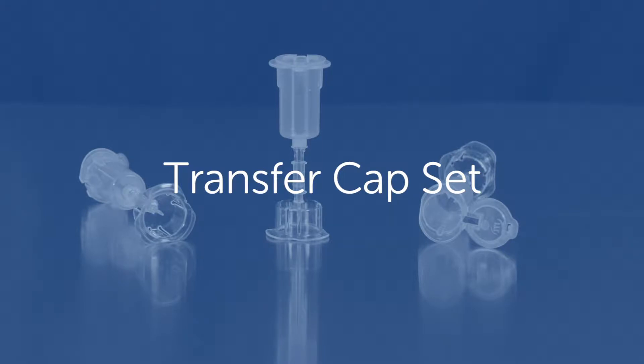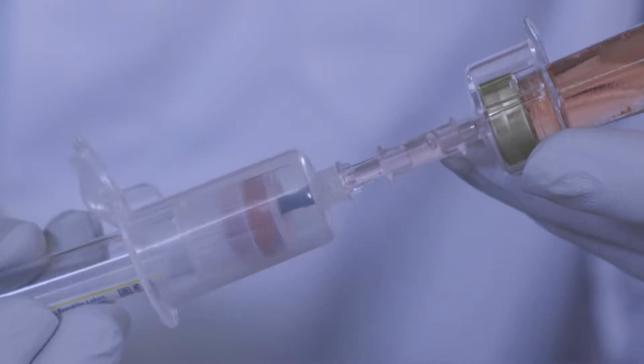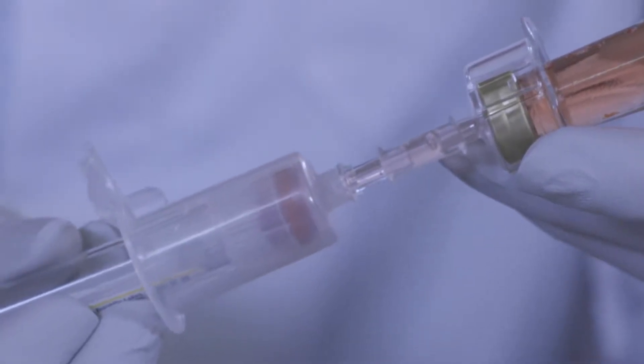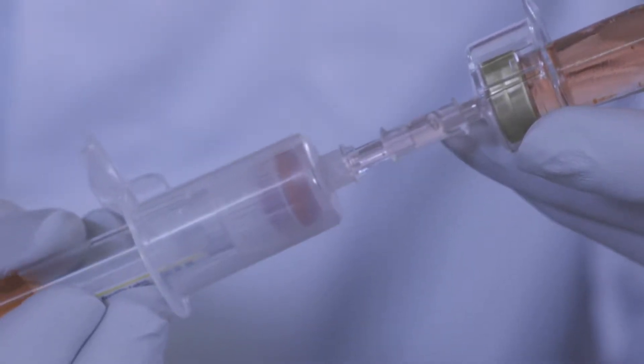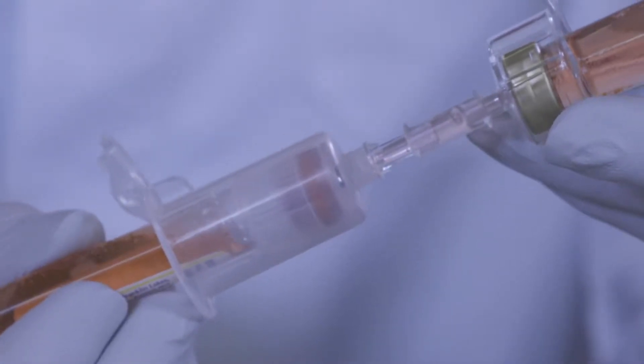The ITEL transfer capset is used to safely transfer sample directly from a blood culture bottle into a vacuum tube. The vacuum tubes obtained from this procedure are typically used in conjunction with automated blood culture streakers and other applications.